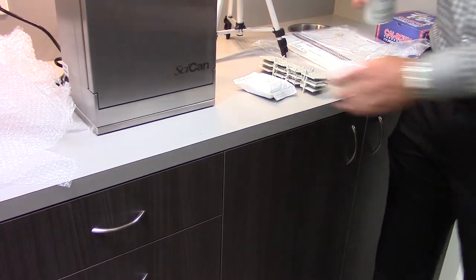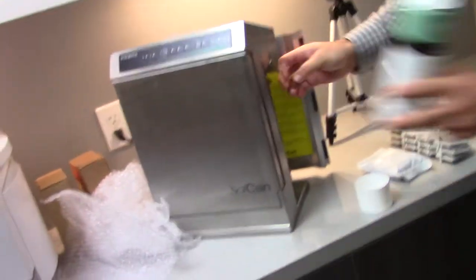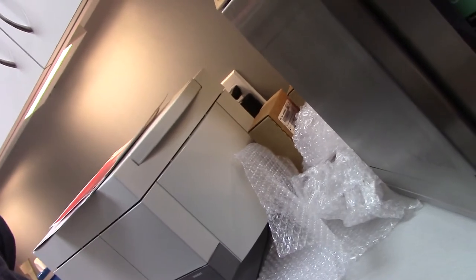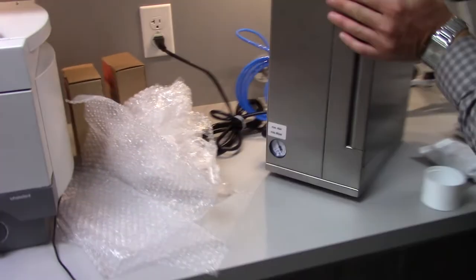You guys can just grab this one. In order to load it, you see over here there's this little brass ring. You just lift that up, insert this until it clicks, pop that down, and that's it. I'll just shut the door here.